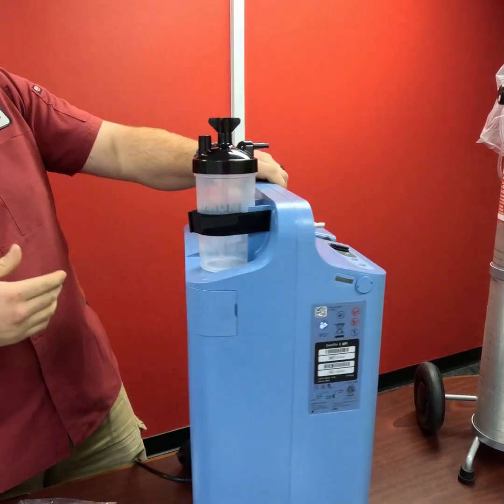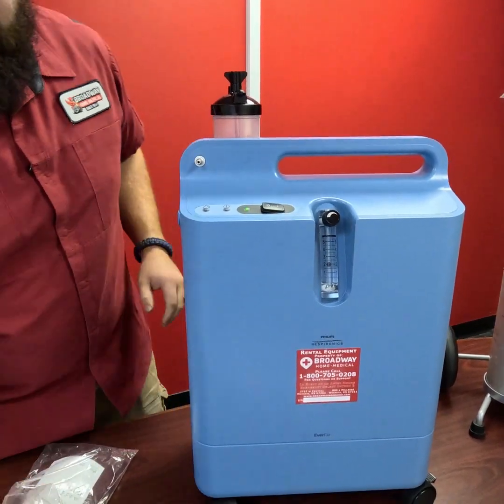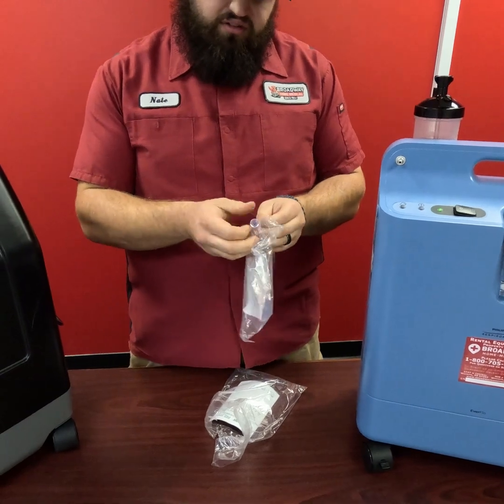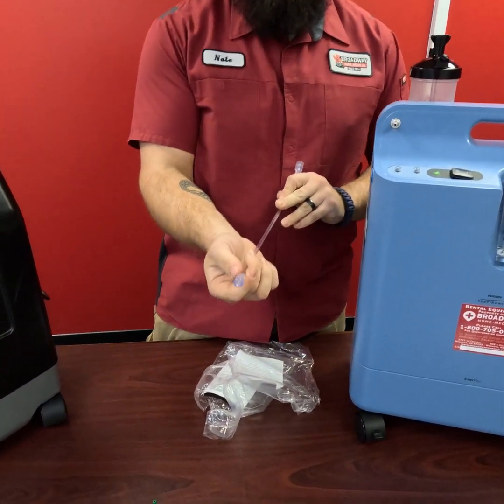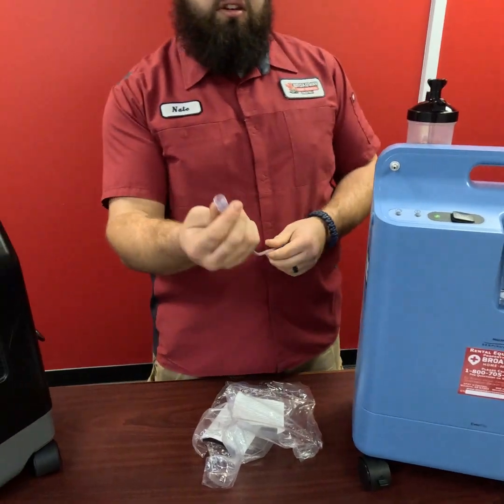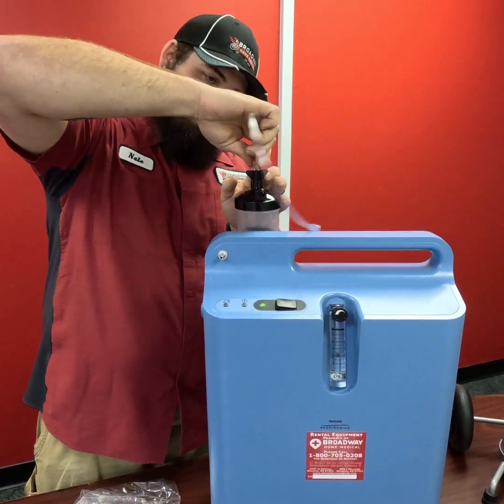Now you may be thinking, why are we putting it way back here, and how is that going to attach to the machine? Well, we'll attach this humidifier jar to the machine with an extra hose. This is a threaded hose. This hose has one female connection on it, and that female connection is going to go onto the concentrator itself, and then the threaded end is actually going to thread into the top of the humidifier jar. So let's go ahead and do that real quick.